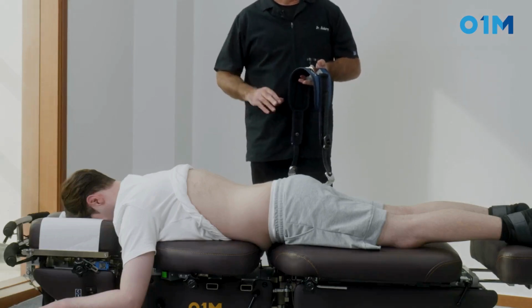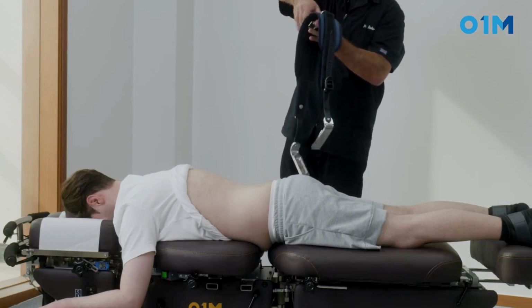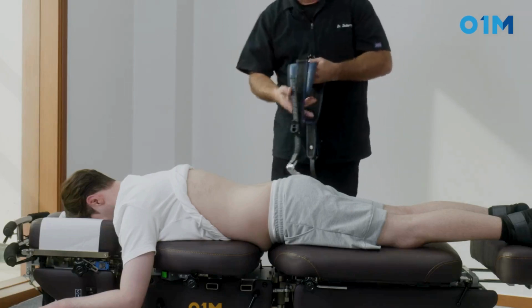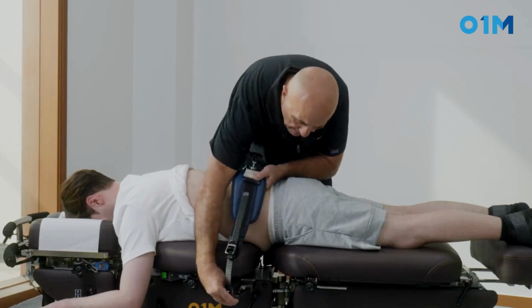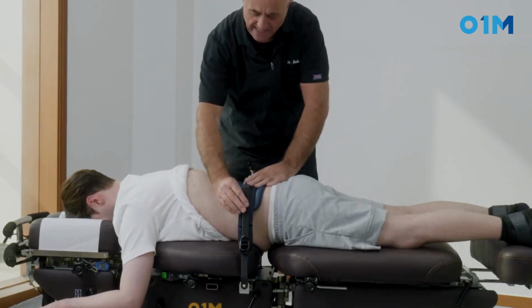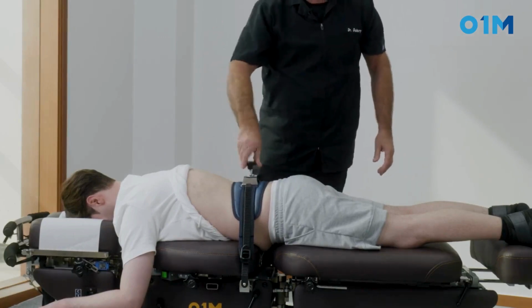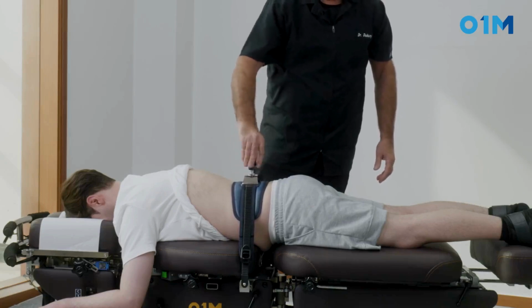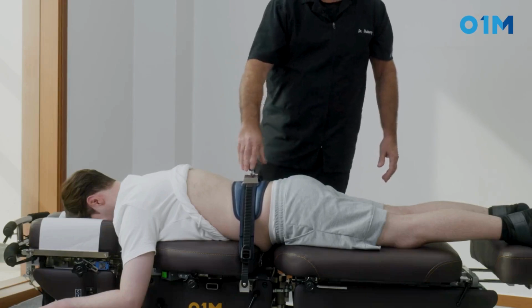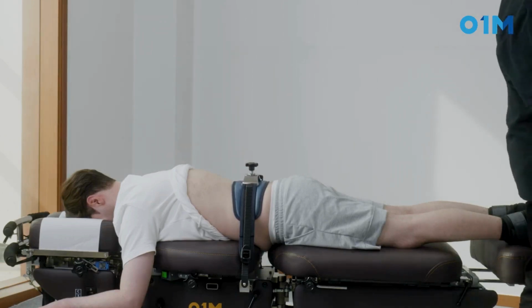You apply it usually mostly with a flexion type of motion of that table. So you're going to make sure initially that this screw is completely up, okay, to allow you to press then on the spine. When you have done that, you're going to hook up on each side, and then, maintaining this straight, you're going to push down the button, tighten it up on both sides. Good. When it's firmly tight, you're going to increase the tension at that level, so it has a smooth pressure on the lumbar, and there is not much gliding to go with it. And it's quite effective. You have to be careful and monitor the patient at the beginning of the session. And we go.